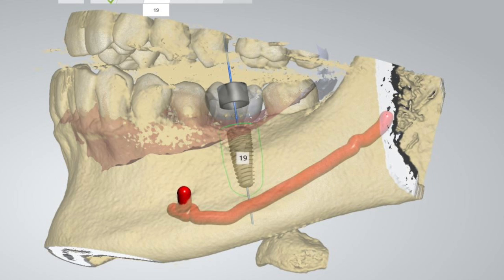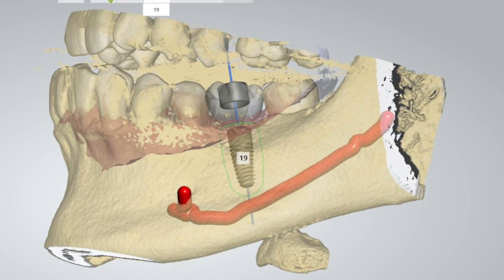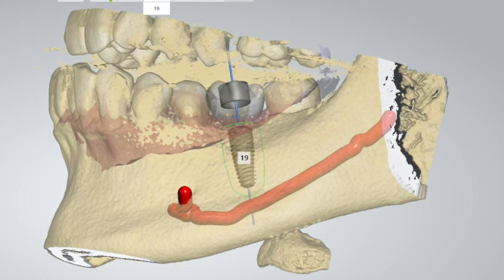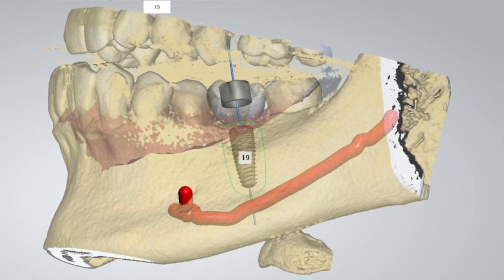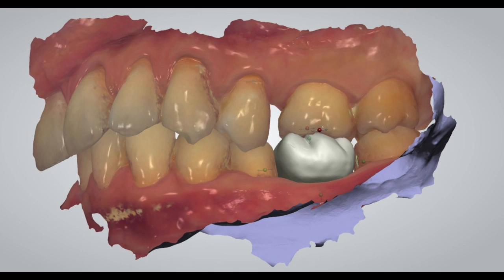The cone beam CT scan is then merged with the oral scan, essentially creating a 3D model of the patient's jawbone, teeth, and gum tissue. Now, we'll digitally design the restoration with the required form and position that fits the patient's bite and also meets the patient's cosmetic requirements.